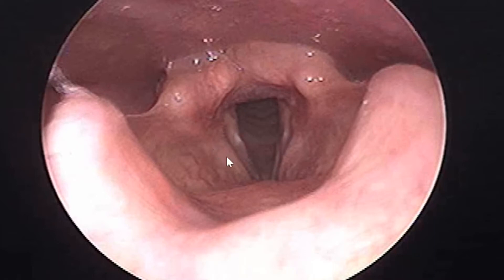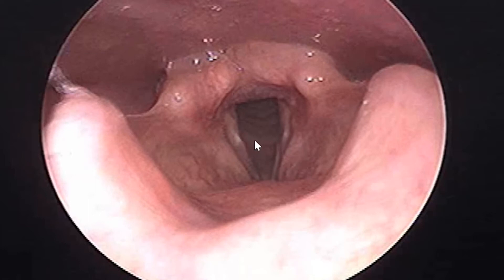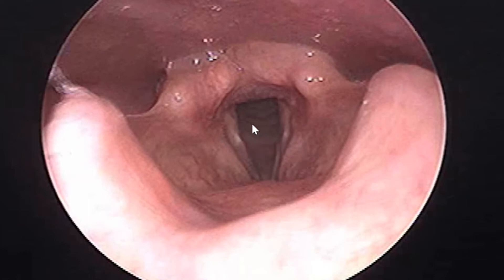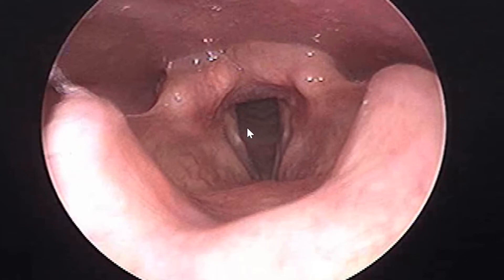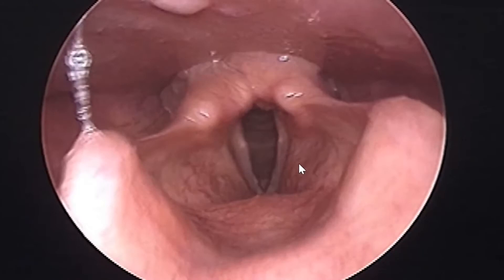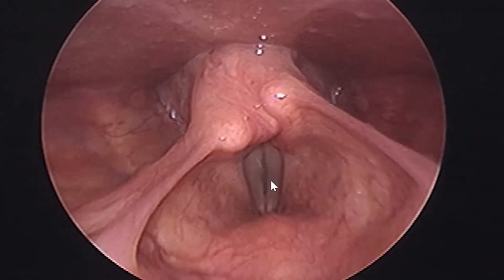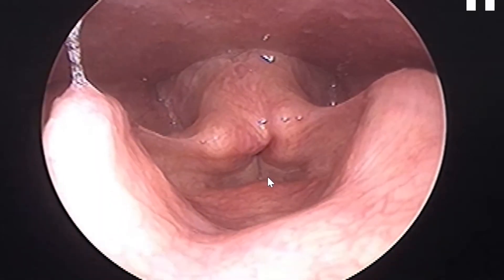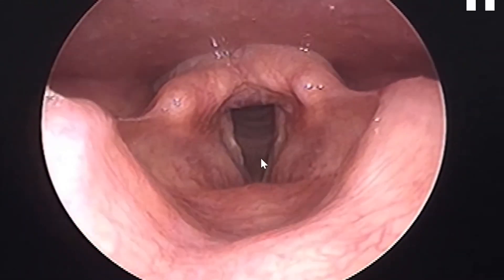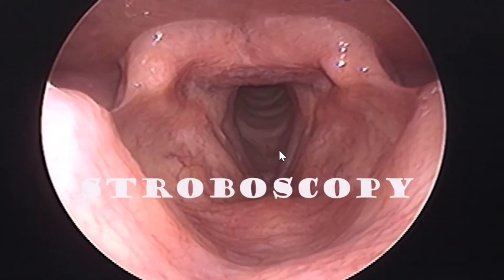These are the true vocal cords, these are the false vocal cords, and this is the trachea. The trachea is never closed because it is lined by C-shaped cartilage which prevents it from closing. In contrast, the esophagus or food pipe is always closed unless food enters. Now again, in the closing position of the vocal cords, you can see the true cords close and then the false vocal cords close.